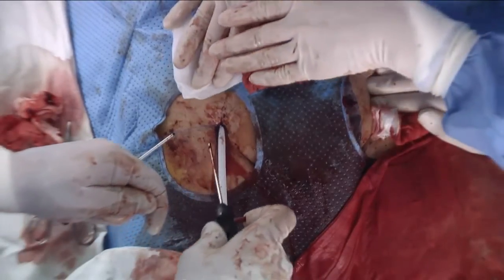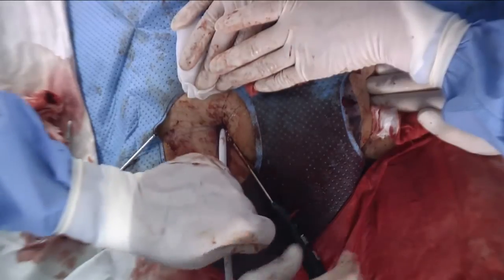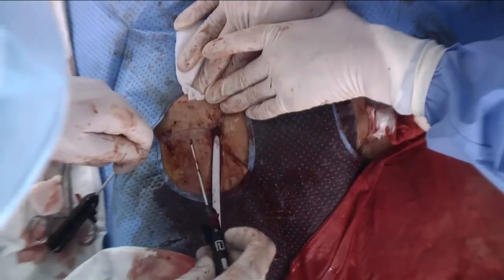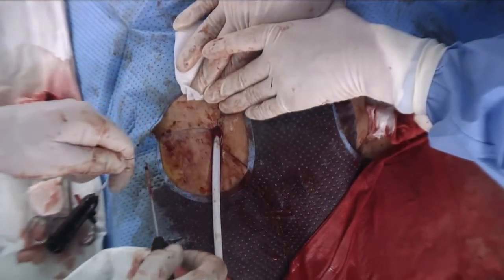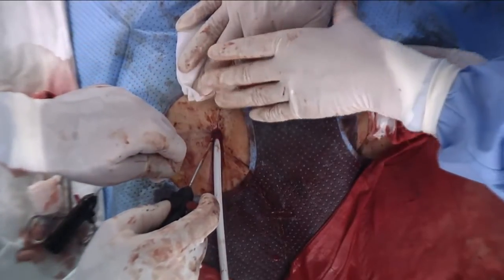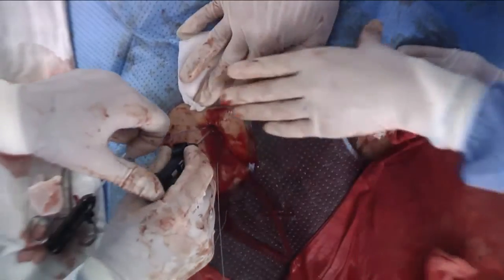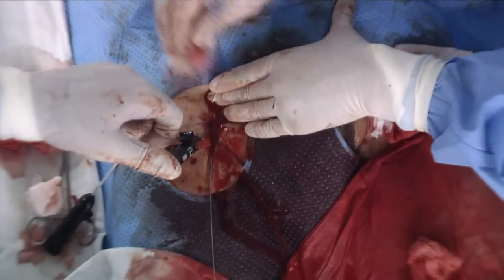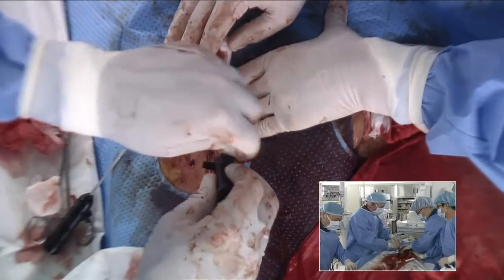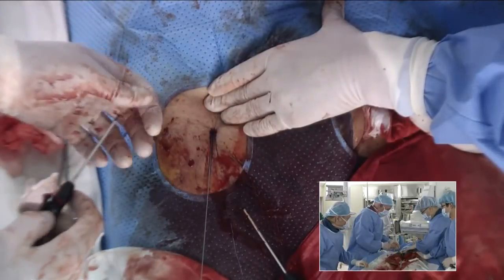So I'm getting ready to deploy. So we can go ahead and, okay, come out with a sheath. Could come out with a sheath now. Okay. And Dr. Park is holding pressure while we try and get at least some hemostasis. So that looks pretty good, actually, with number one. Now we'll slide number two down.